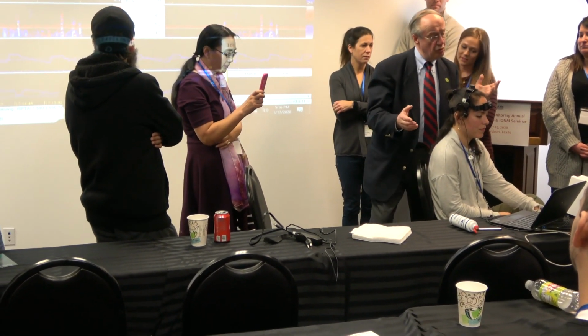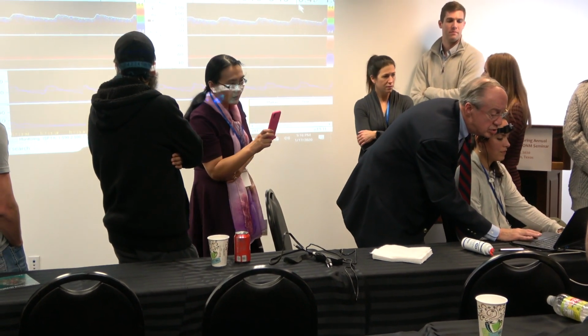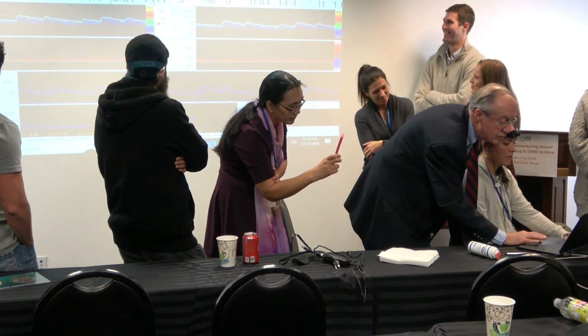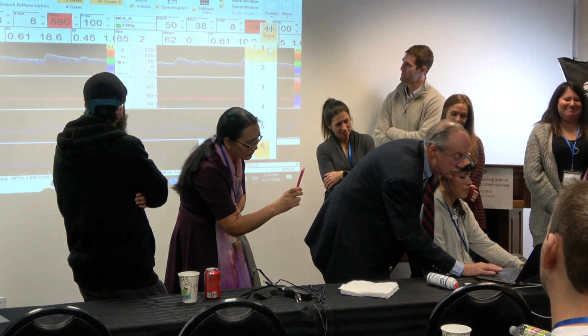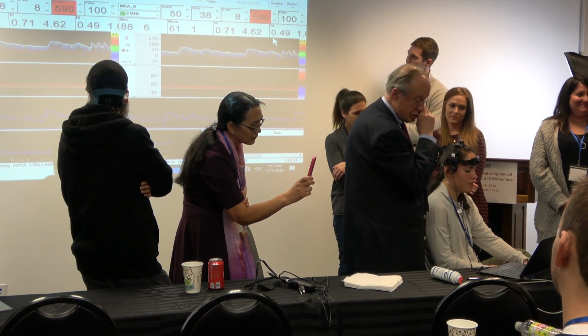So now it is almost perfect. The sweep time didn't change. So I changed sweep time.